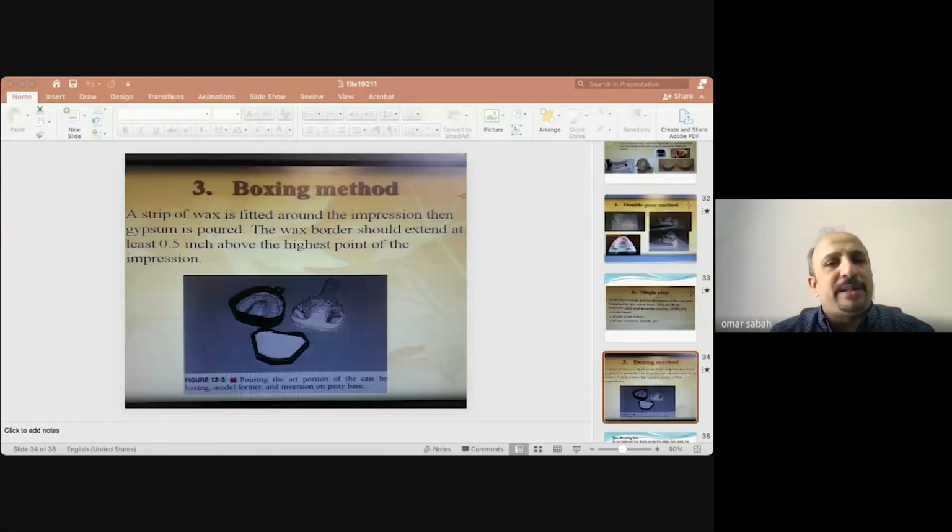يعني مرات تكون الماتيريال مال الستون مالتي بعد ما كان صارت سيت او انيشيال سيت، وانا من اجيب بلاسترز، البلاستر راح يجر الستون لانه اثقل، راح يجر الستون ويقعد هو مكانه. بس انا ما اريد هذا، لانه انا ما اريد البلاستر يصل على منطقه اللي هي بها الرج، لانه انا بعدين راح استخدم البيس وراح استخدم الهيتر والهوت ووتر وراح يستخدمه بالكيورينج، راح يصير حراره عاليه، فممكن البلاستر يصير بينه ديستورشنز. انا ما اريده، انا اريد الستون.